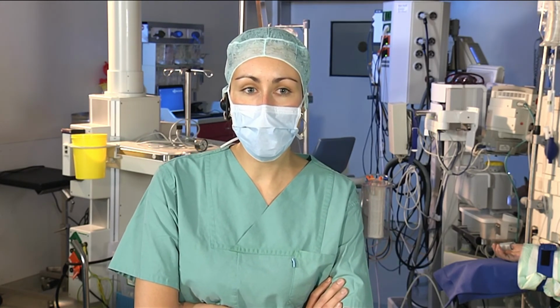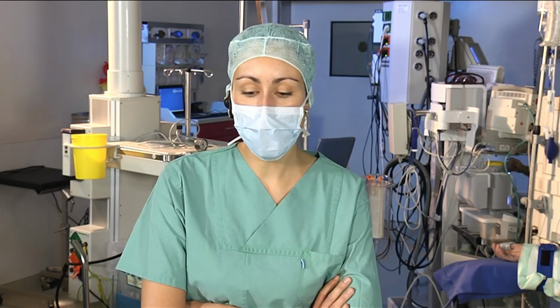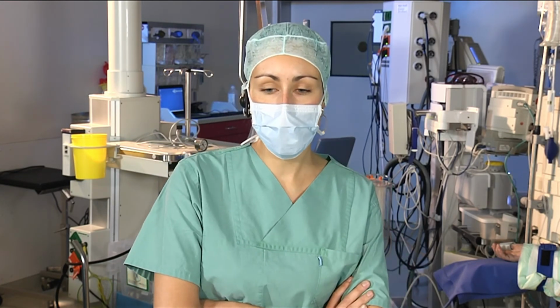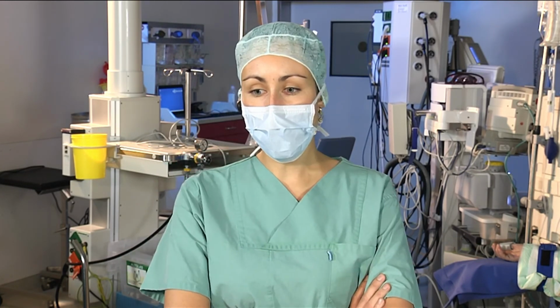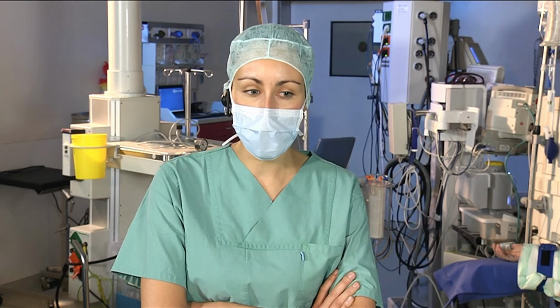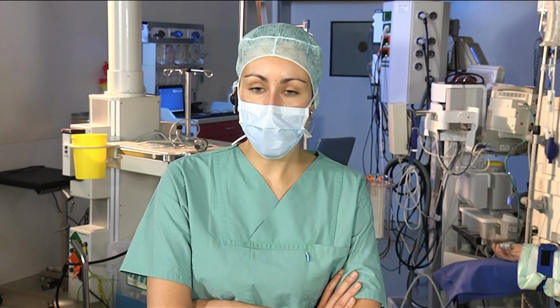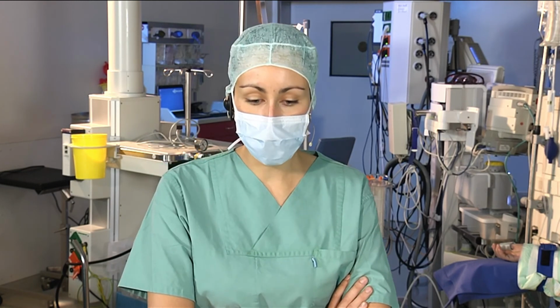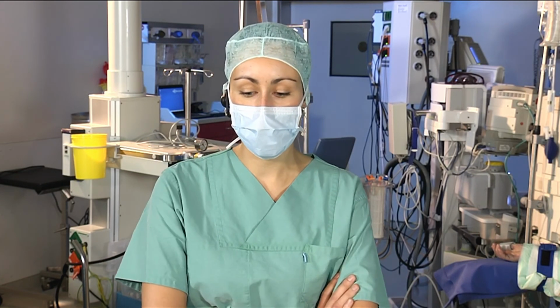Yeah, this is a very good point. Actually, we did, but it didn't stay there. But in this patient, we didn't force it because the main arteries were coming from the true lumen, and we were not concerned about the left renal artery, which arises from the false lumen, because it was not perfused well already, and the kidney is not working on that side. So we didn't worry about that too much, but this is exactly a very crucial point, and it's good that you mentioned that. It should be tried, if possible, that this tail can be pushed up a little bit.